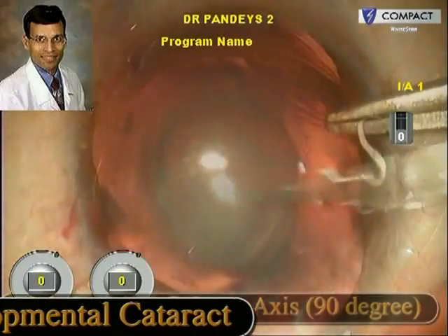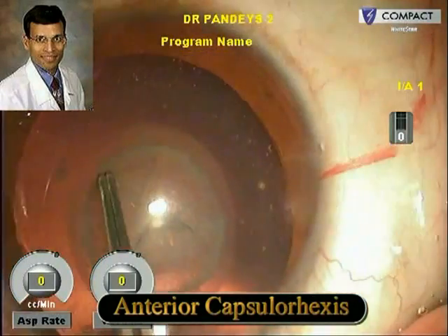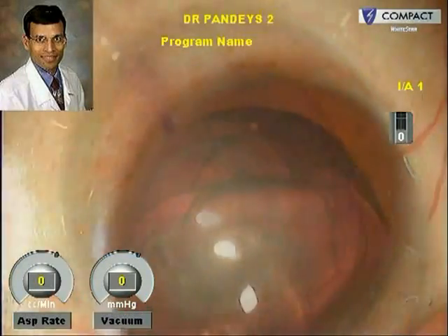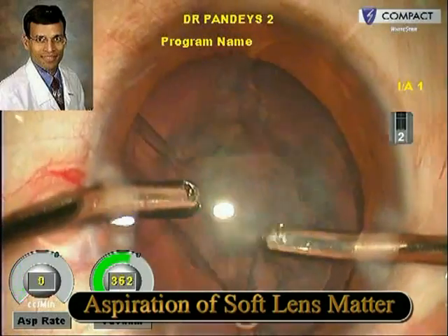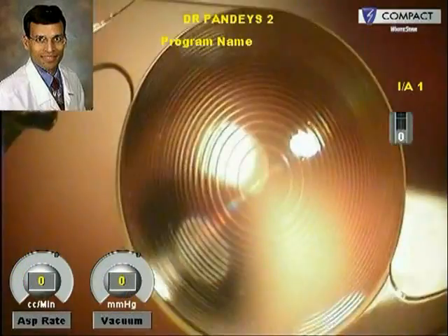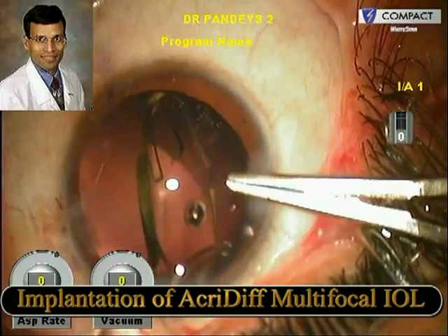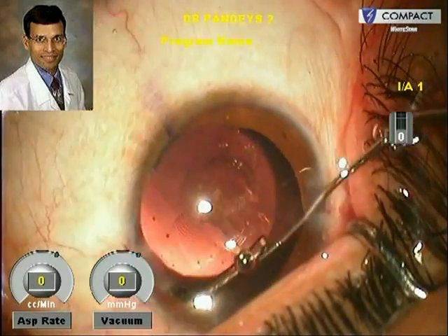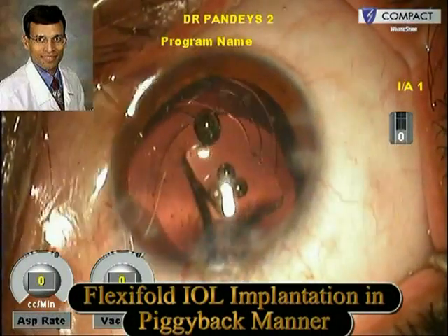This is the standard surgical procedure with the main incision at the steep axis and the sideports being made, and the anterior capsulorrhexis, which is crucial not only because this is a developmental cataract but also because good centration of the IOL is crucial in all refractive cases. The lens in this young patient was soft and could be easily aspirated using bimanual irrigation aspiration. We then implanted an Acri.DIFF multifocal IOL of plus 29 diopters in the capsular bag. The total power of plus 32.5 diopters needed was not available as a multifocal IOL commercially, so we implanted one multifocal IOL of plus 29 diopters in the capsular bag and another plus 3.5 diopter hydrophilic acrylic IOL in the ciliary sulcus.